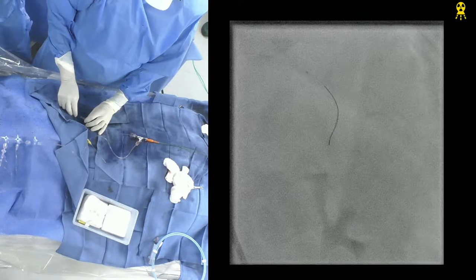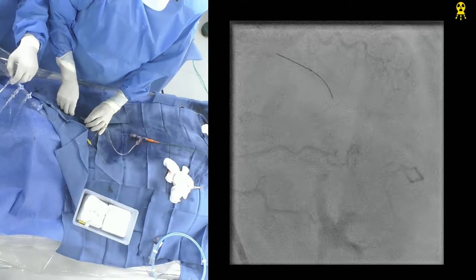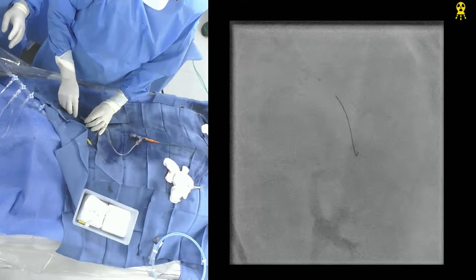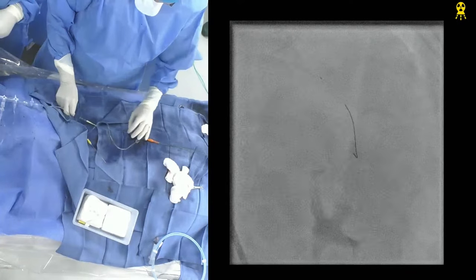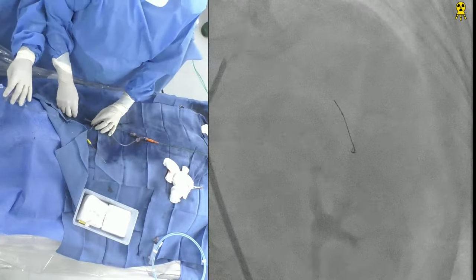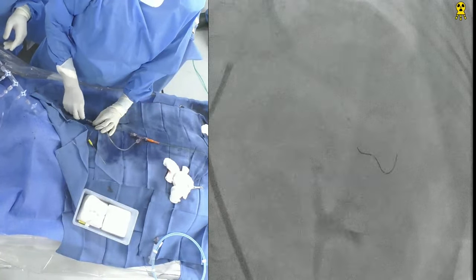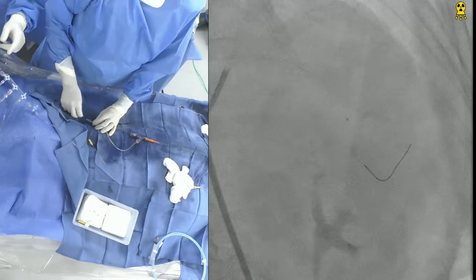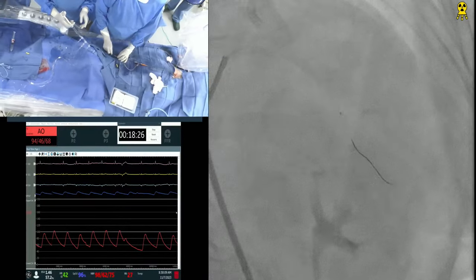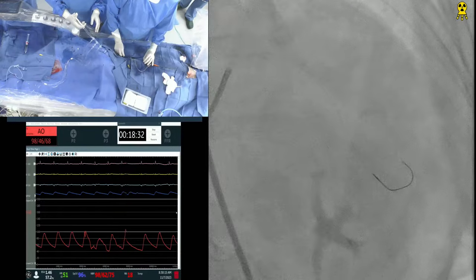Okay, now some dye. Okay. You're through the lesion into a septal there, but I think across. Yeah, it's very tortuous there. Should we open the shutter? Okay. I think that's probably the way LAD is going up. Yeah, but then go down. Okay. Yeah, that's fine. Get me a 300 run through, right? Yeah. Good.